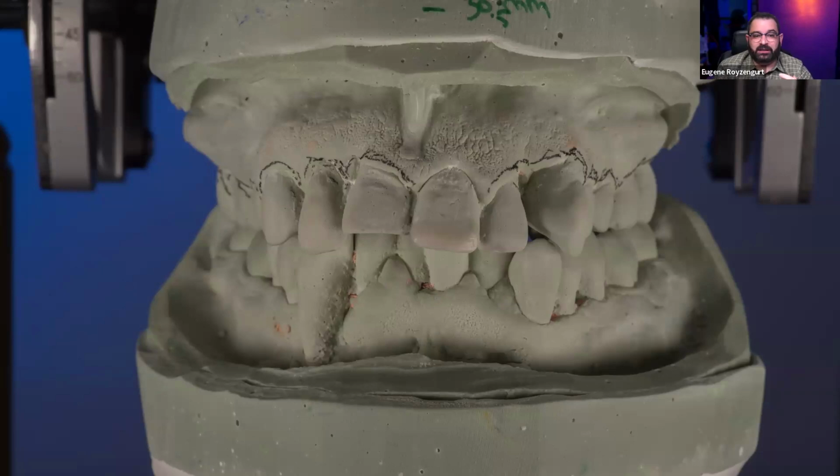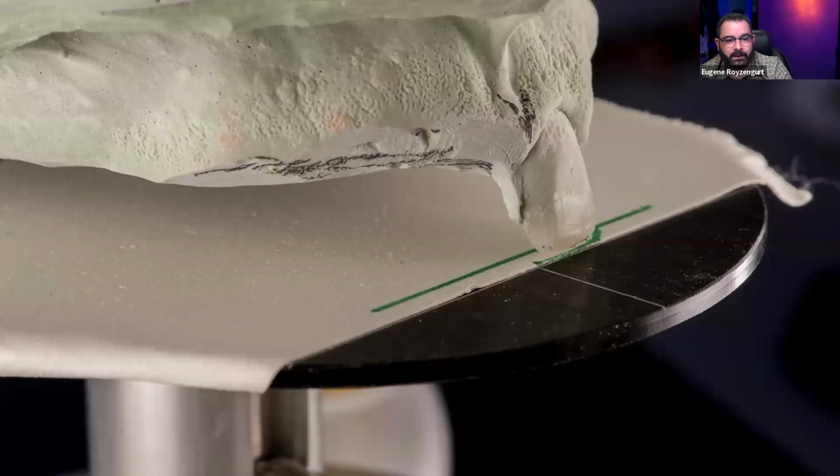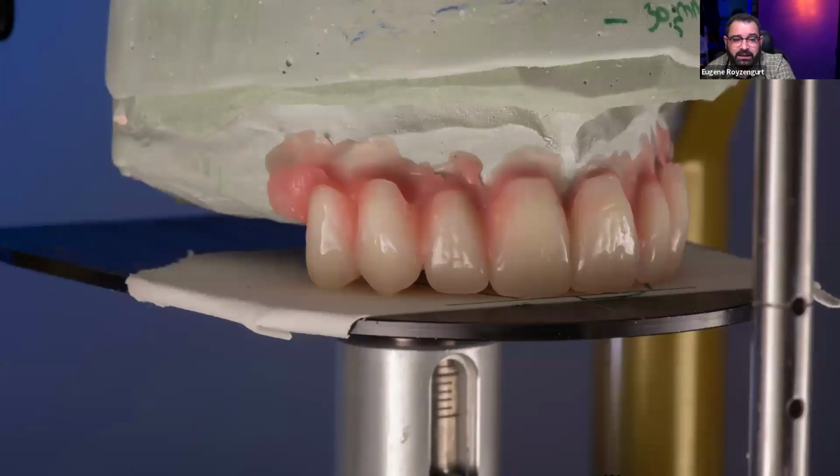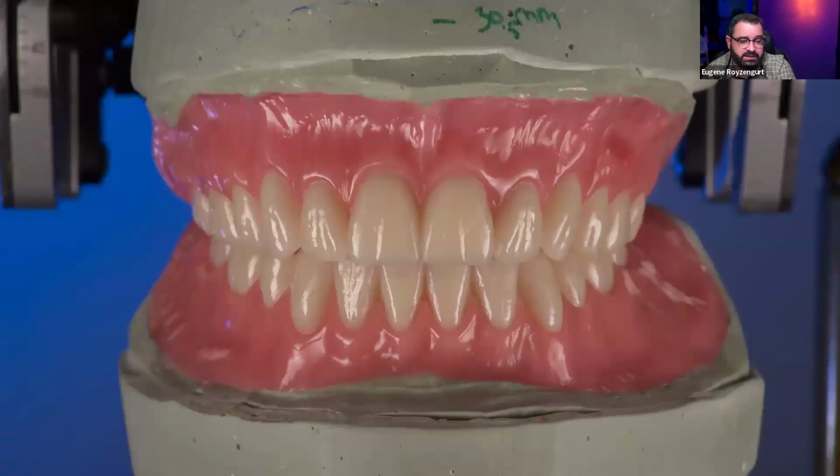And it made it a little bit difficult because I couldn't line things up with patients' pictures, with patient scans and stuff like this. So I did this in analog. As you can see right here, I actually took a golden proportion and I've waxed up this central to give me the proper length, and I've adjusted everything to it. But we also talked about doing a bunch of bone reduction because the patient has such prominent bone presence. And we did good. I mean, it ended up looking pretty good. So this is the setup.